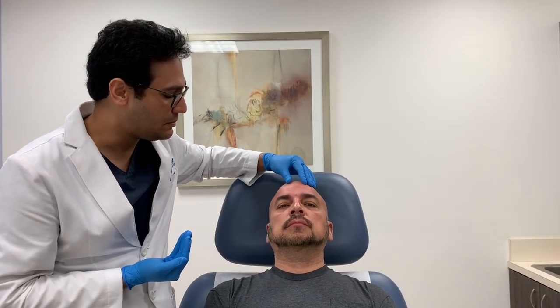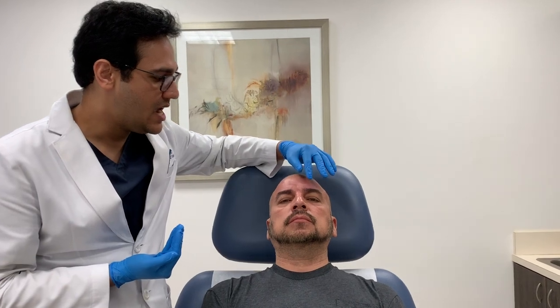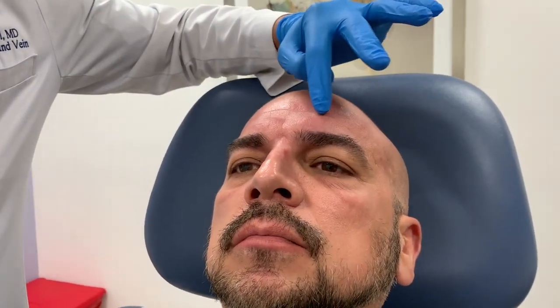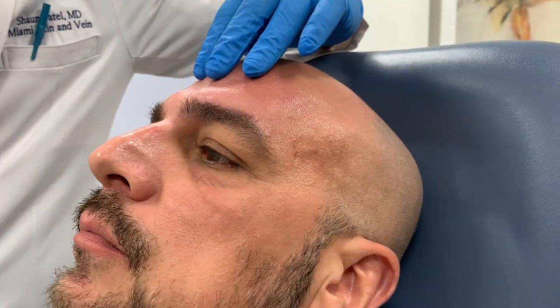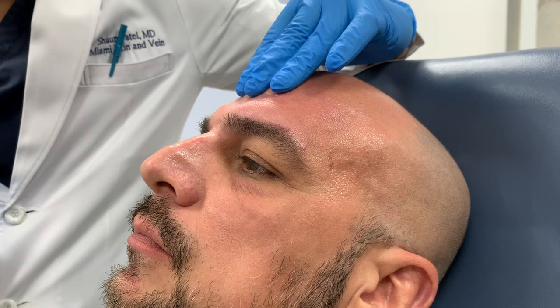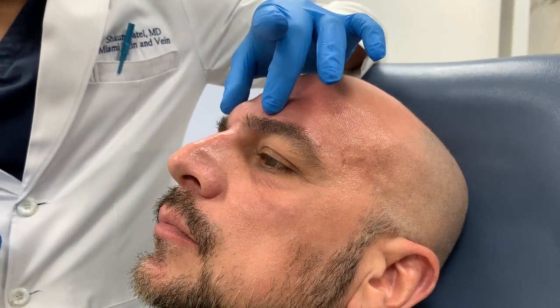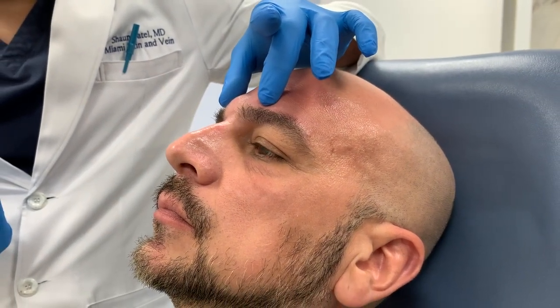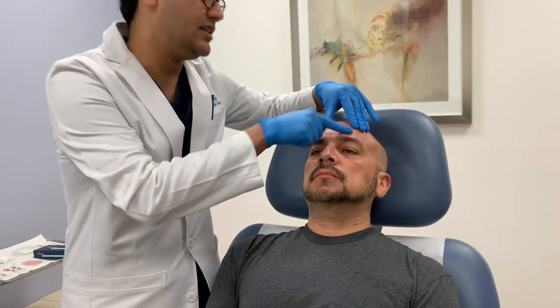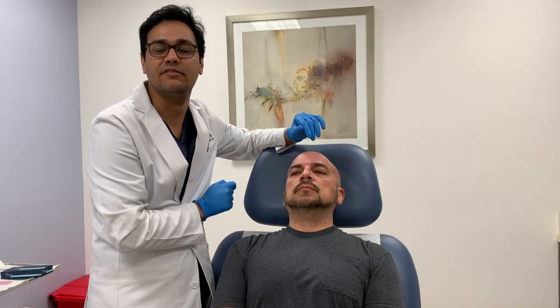We're going to relax those muscles with Dysport. But if you look at his forehead closely, you can also see, in addition to the outline of the muscle, he's got a hollow in his forehead, so I'm going to treat that area with a little bit of filler as well. The combination of filler in his forehead and relaxation of the muscle should give him a smoother forehead, with less of these horizontal lines as well as the frown lines.